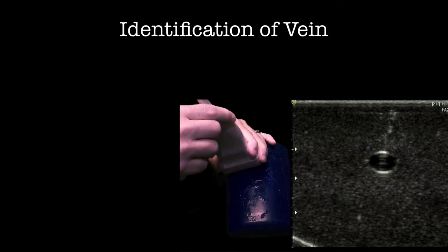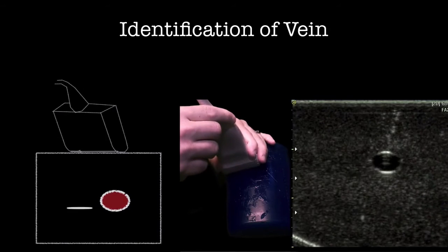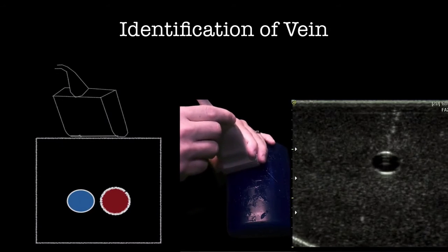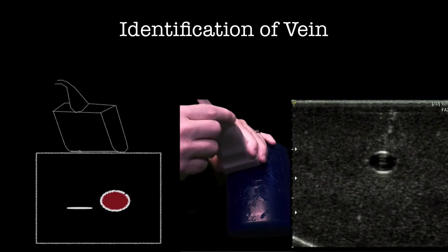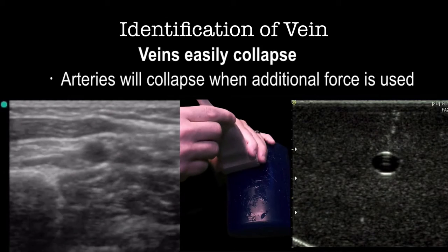A common mistake with this technique is misidentification of the artery and the vein. Veins can only be identified in short axis where they appear as a circle. The transducer is placed on top of the vein, and veins will collapse easily with pressure. Arteries will not collapse unless a lot of pressure is used.